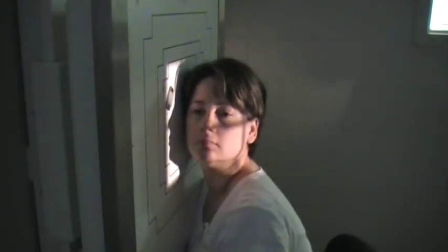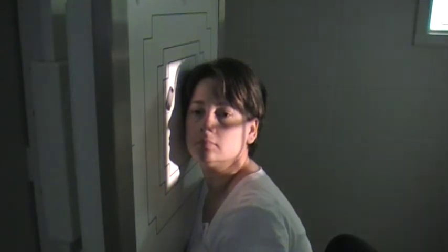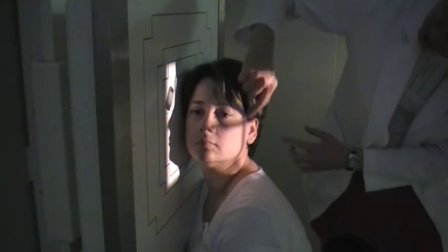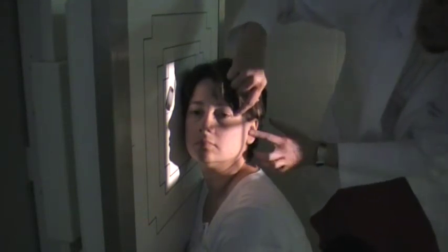Now I'm going to do the right lateral. Just position the head as if you're doing a lateral skull. Check your interpupillary line and make sure it's going perpendicular. Check your midsagittal line and make sure that it is horizontal. The right side of her face is up against the board, so I'm going to put the right marker. The central ray will be perpendicular, and for the lateral for facial bones, it's going to come halfway between the outer canthus and the EAM.